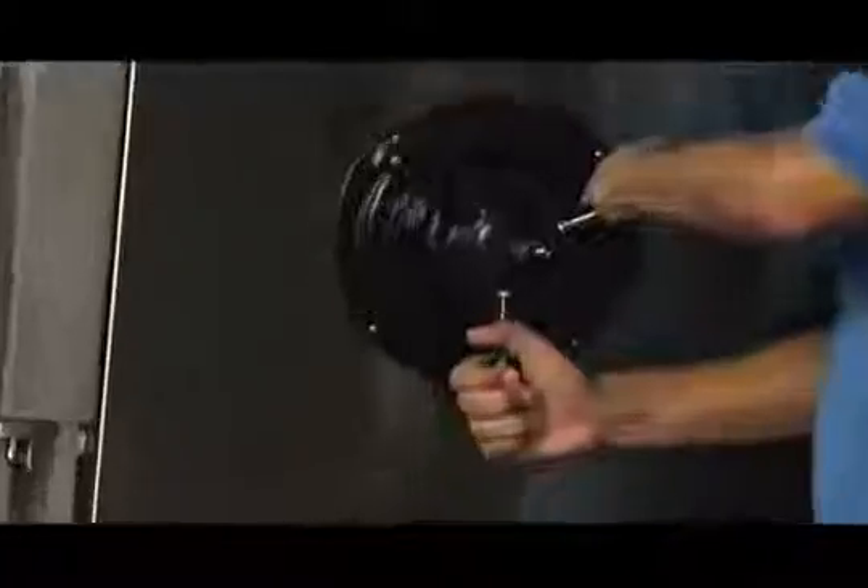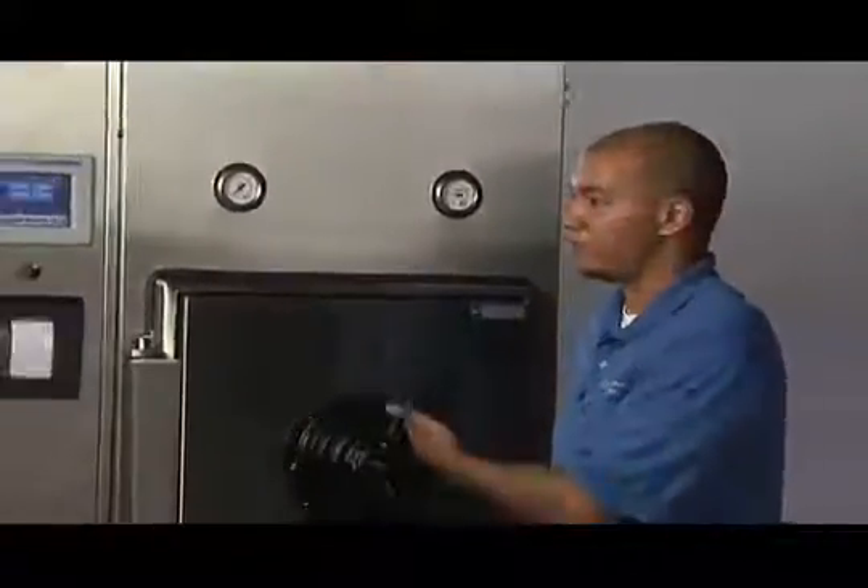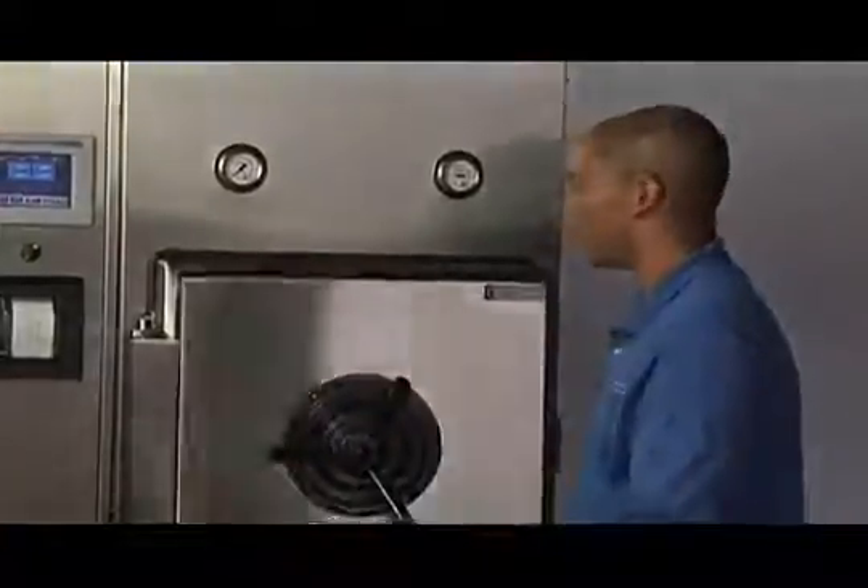After turning the handle slightly to the right, begin unlocking the door by turning the handle all the way to the left. After the handle has been turned all the way to the left, the gasket seal has been broken and the door swings open freely.